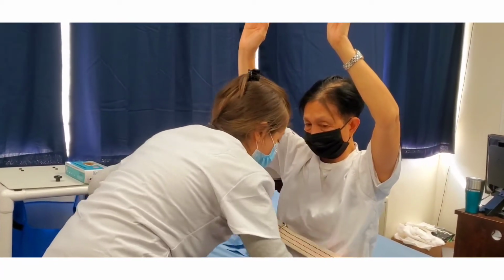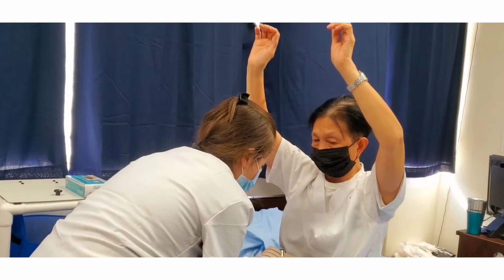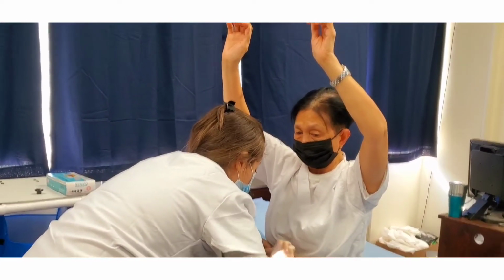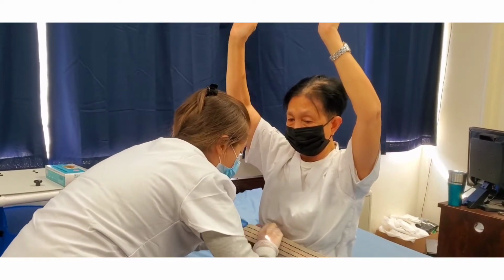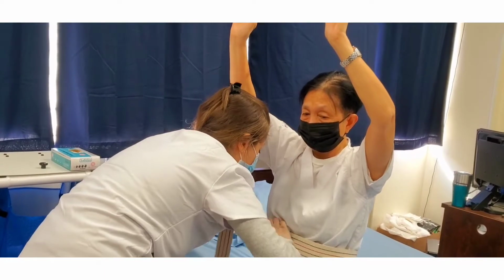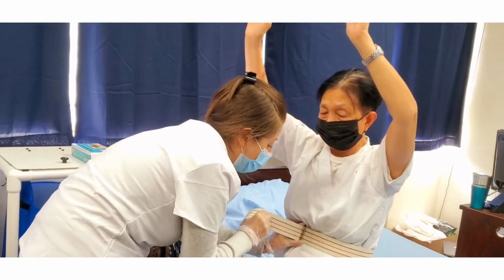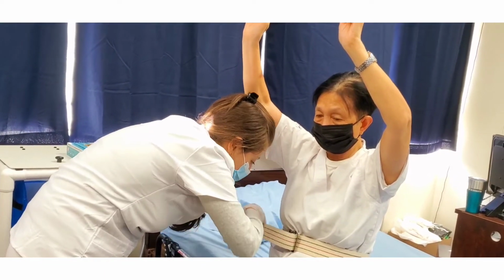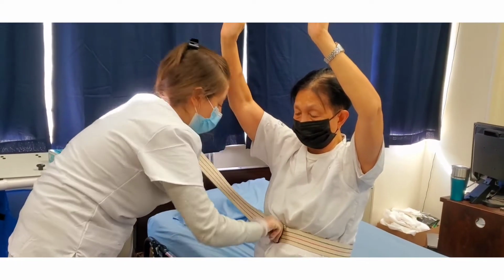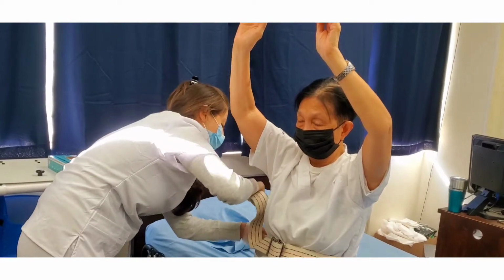Make sure the gait belt fits snugly. Not too tight, not too slack, but it has to fit snugly. Move it a little bit towards the side. Yeah, tuck it in, from the belly button. Mm-hmm, tuck it in. Push it in here. Very good. To the loop, and I will tuck it in on the side.